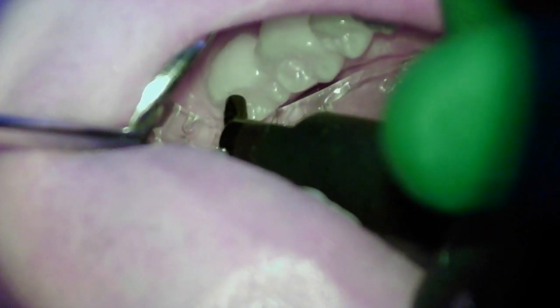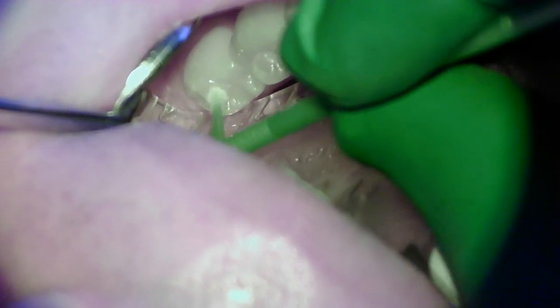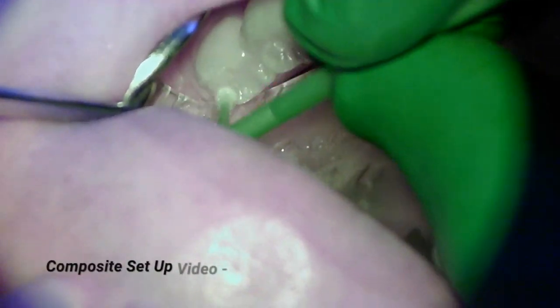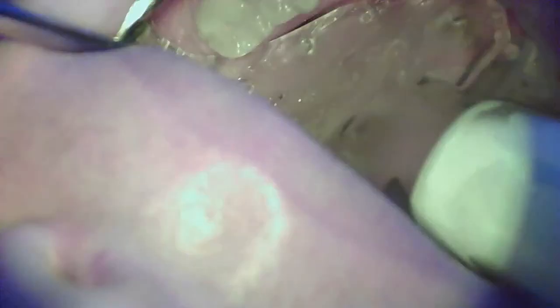You just saw the doctor apply a layer of flowable and now applying some composite. There are different instruments used to spread and shape the composite and we talk more about those in our composite setup video mentioned earlier. This one is just a simple occlusal so nothing much complex is happening.